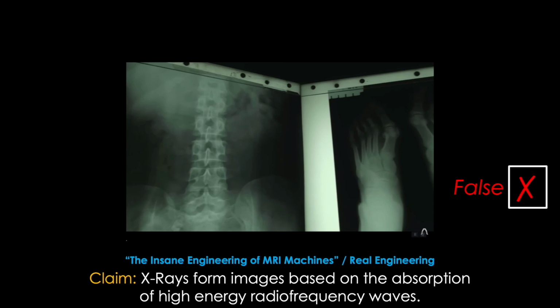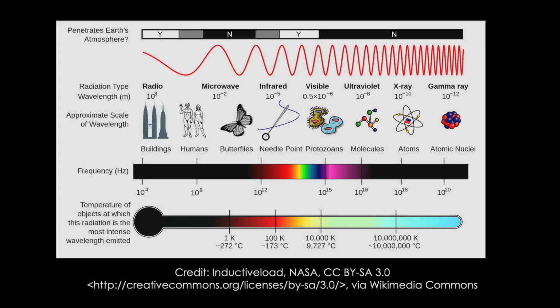Okay, let's just get this one out of the way quick, and this may be a slip of the tongue as we will be discussing radio frequency waves throughout the lecture. X-rays are not radio frequency waves. They are X-rays, right? It's in the word there. A quick look at this diagram of the electromagnetic wave spectrum shows X-rays here, above both visible and ultraviolet light. They are high energy and cause ionizing radiation, which has the potential to harm the body. Radio frequency waves are way down here, are very low energy, and do not cause ionizing radiation, but can deposit energy into tissues.